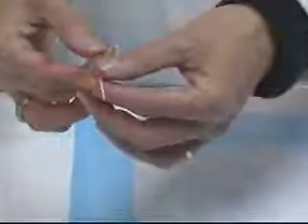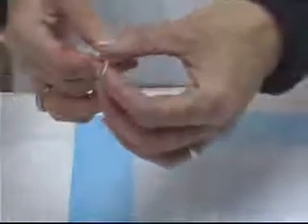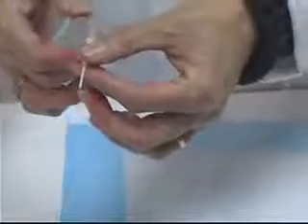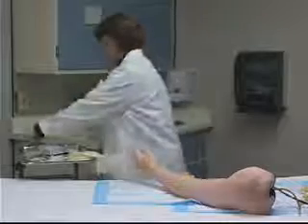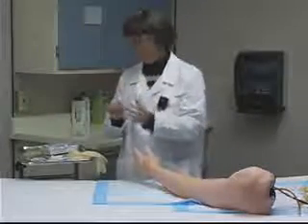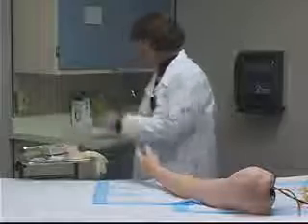I also want to give a little turn of my catheter on my needle so that I know when the time comes that it will easily come apart and allow me to disconnect it and connect the IV tubing. I just put it back into the protective covering to maintain the sterility until I'm ready to insert the needle into the vein. And I can open up my occlusive dressing and have that ready to go. I can also prepare my tape.